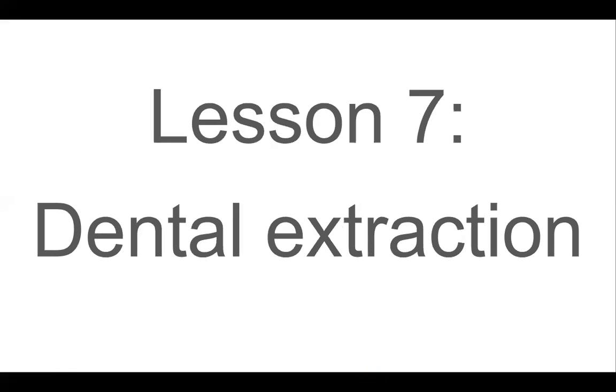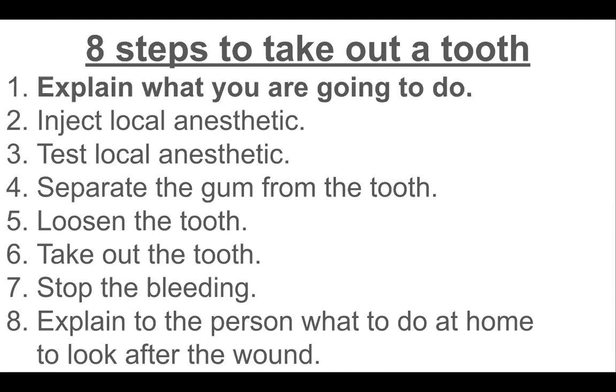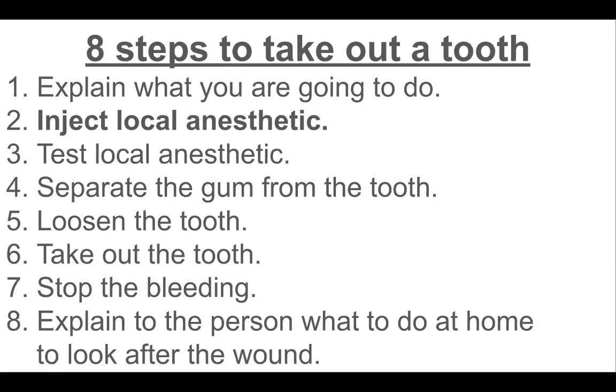After that, there are some steps of the dental extraction. There are 8 steps to take out a tooth. First, explain what you are going to do. Always begin by talking to the patient. Explain why you must take out the tooth, tell how many teeth you will take out, and ask for their permission. Begin working only when the patient understands and agrees.